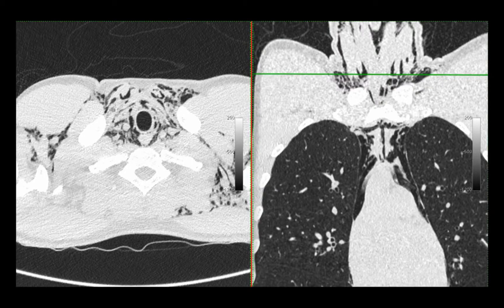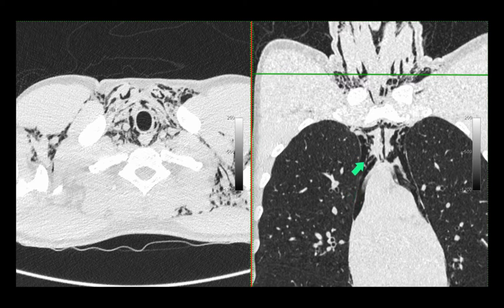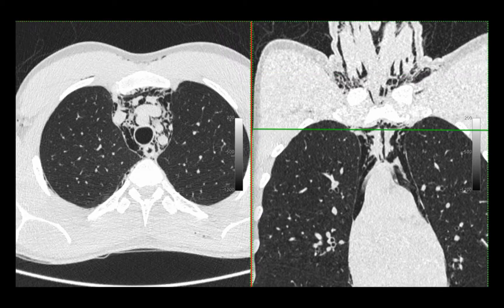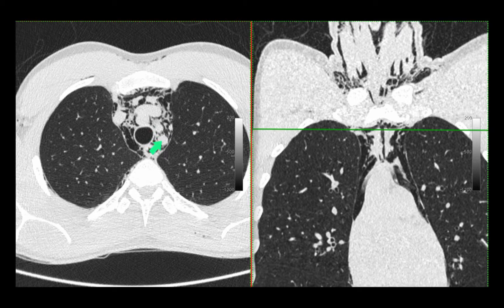The CT shows very nicely the gas tracking in the subcutaneous soft tissues. It outlines the trachea and the oesophagus, and you can see the nice delineation of the mediastinal structures. All of this structure here is mediastinal fat, which has been displaced by the mediastinal gas. You can see the left brachiocephalic vein, the brachiocephalic trunk, the left common carotid artery, and the left subclavian artery.